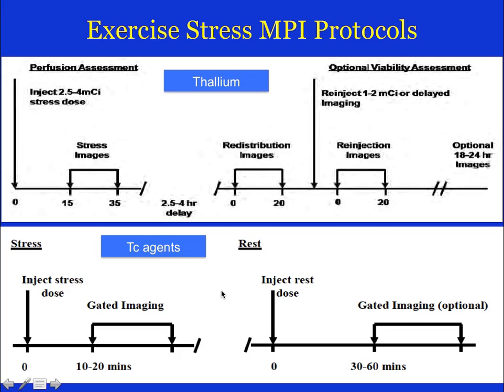Now for the technetium agents, we need 2 injections, one during the stress imaging and the other during the rest imaging.